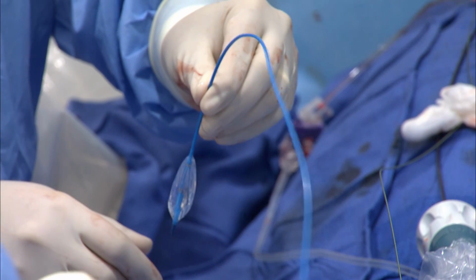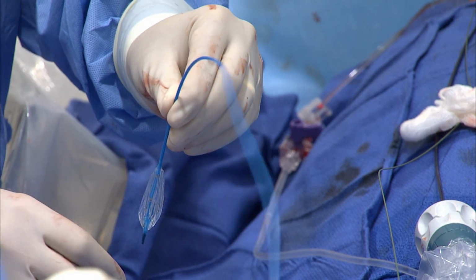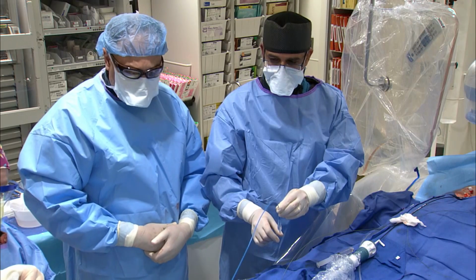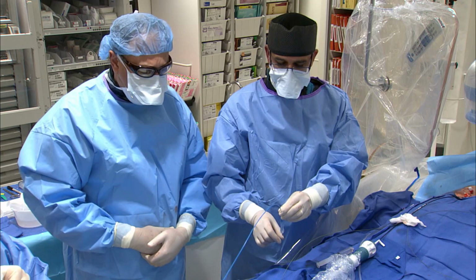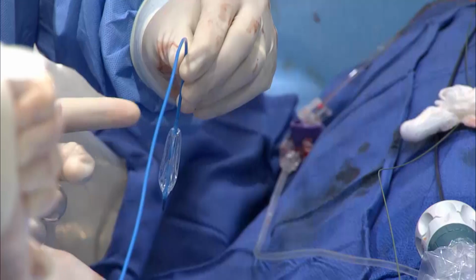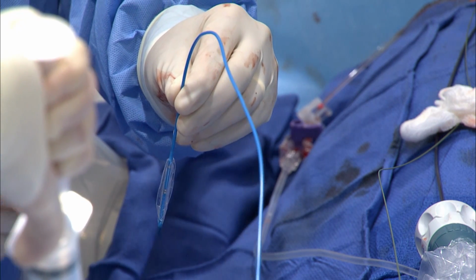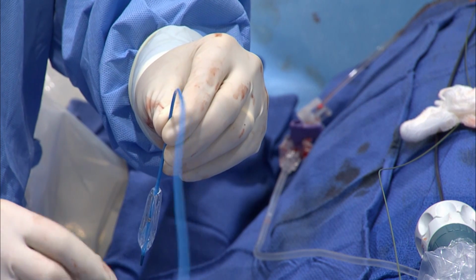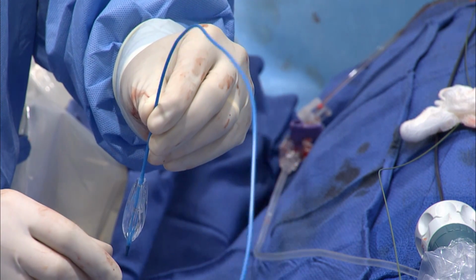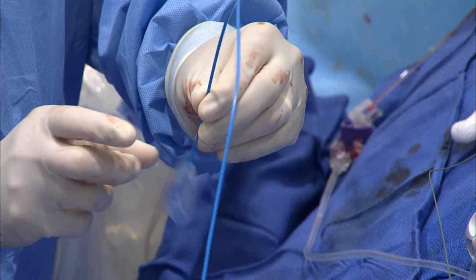With these big balloons, just like we do in aortic valvuloplasty or any other large balloon prep, we inflate the balloon outside the body and keep it in an inverted position so that the air goes back through the balloon shaft towards the inflation syringe. It's a huge syringe, so it requires a lot of pressure.